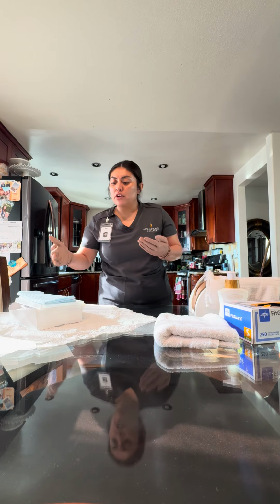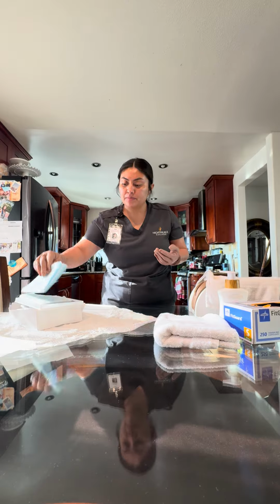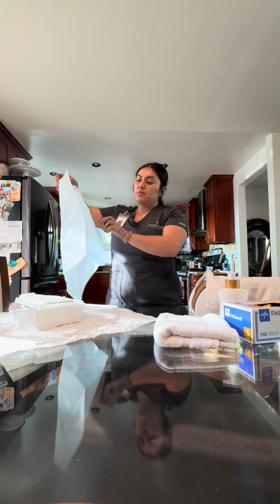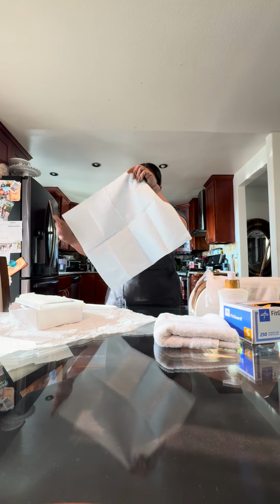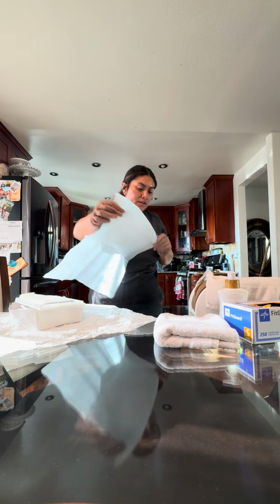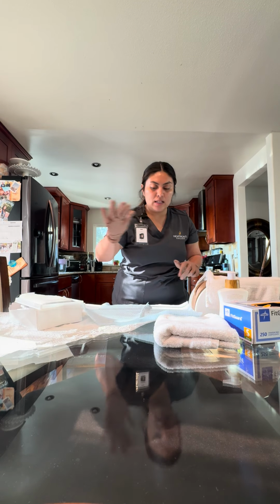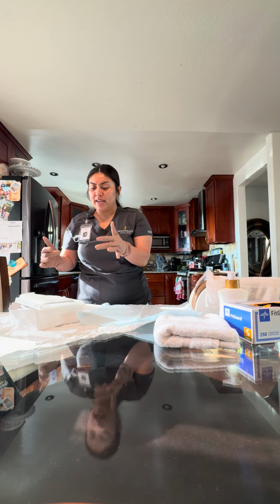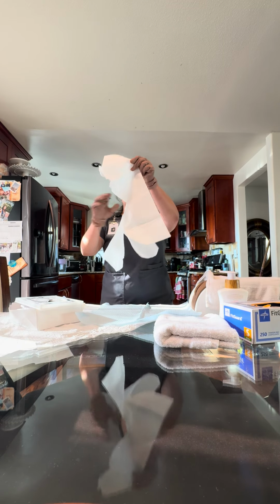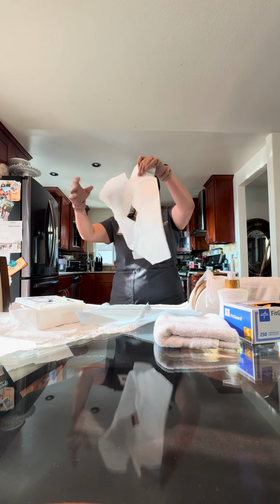I'm going to be grabbing the drape, shiny side down. I'm going to be asking the patient if she can lift her hips. I'm going to be placing the drape under her. I'm going to grab my fenestrated drape and place that over my patient.